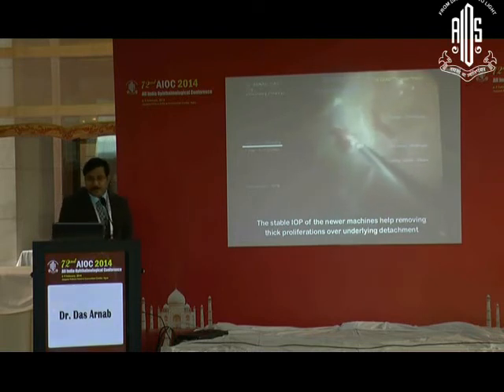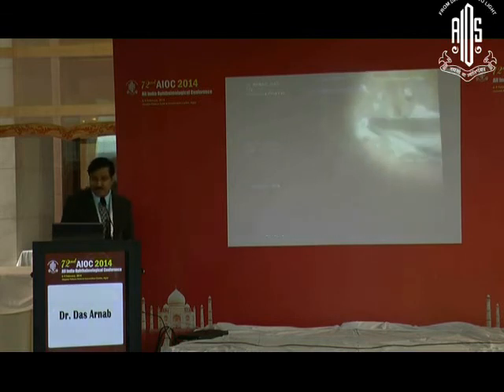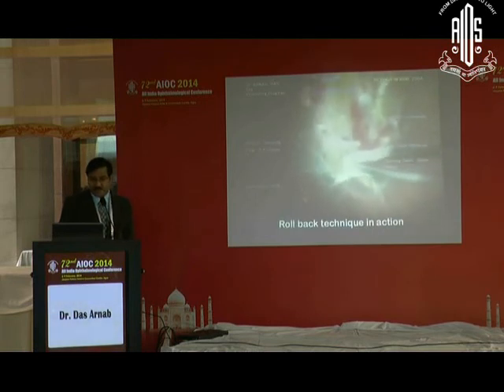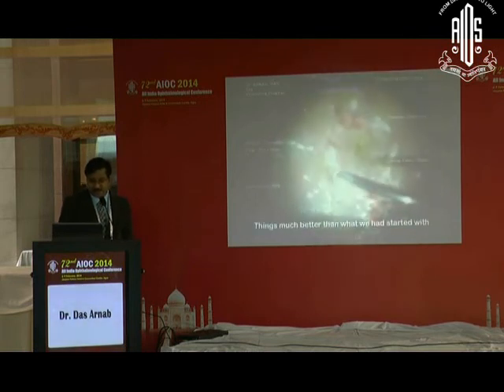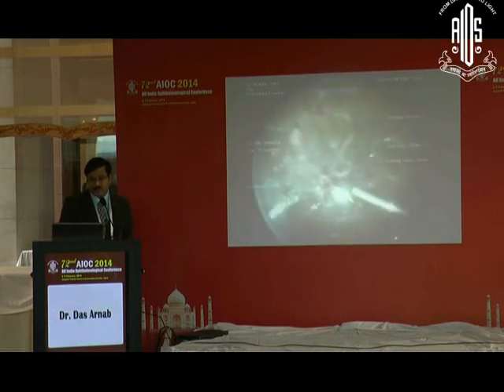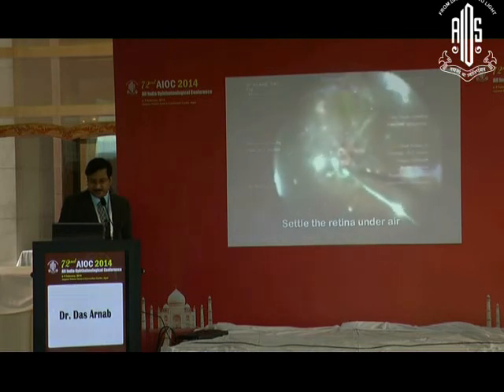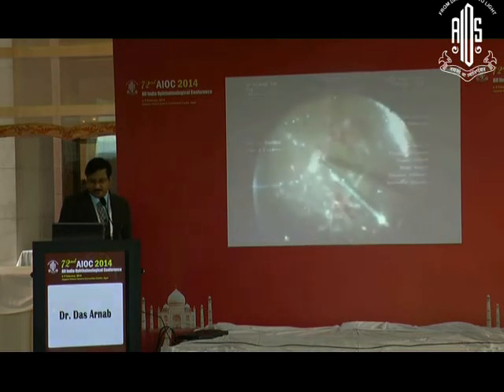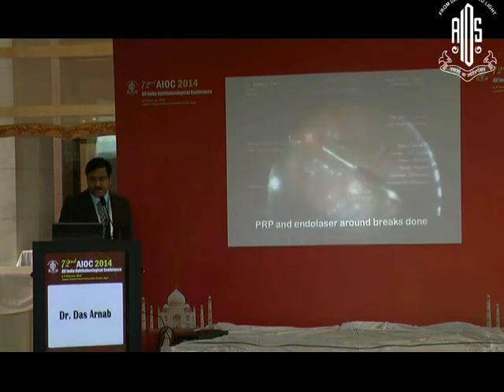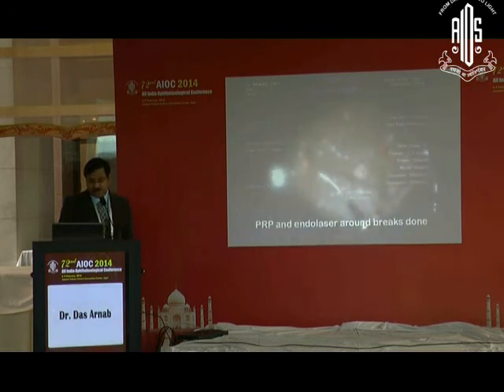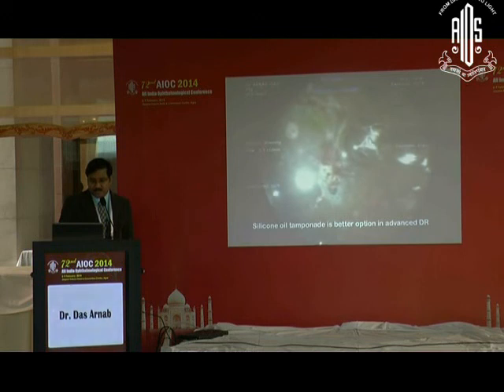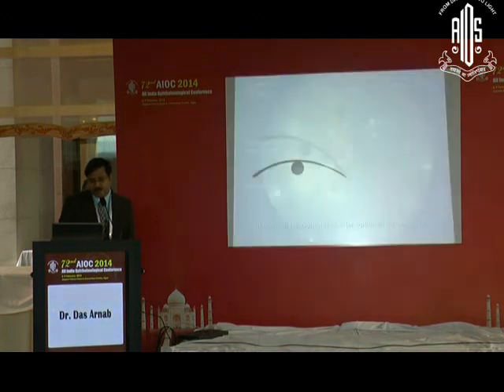The stable fluidics of the new machines help in removing the thick proliferation over the underlying detachment — it gives you a very stable feel. Again, roll-back technique in action. Things are much better than what we had started with, and the retina is settled under air. PRP and endolaser are performed, and silicone oil tamponade is a better option in these advanced cases.